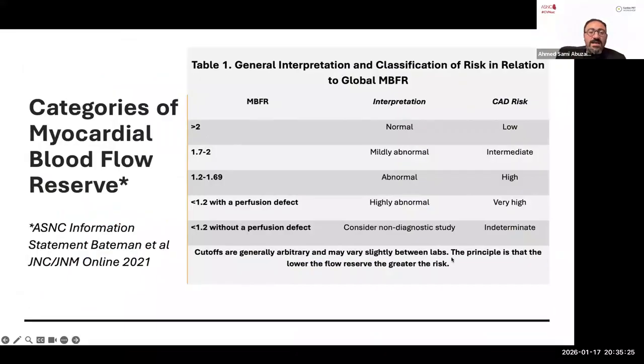And I think we have to understand also that if we see low myocardial blood flow data without a perfusion defect, this is a message that we have to make sure the numbers correlate and there isn't a technical difficulty or technical abnormality when we plot it with the perfusion. Because the perfusion may be true and the blood flow could be true, but we just need to make sure we are getting the right number, and that we are not facing a non-responder patient, a patient that does not respond to the stress agent.